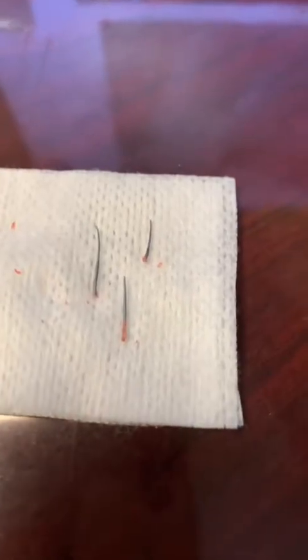These are the plastic Thermafil obturators I pulled out of the canals. So this came out of the mesiobuccal, this came out of the mesiolingual, and you can see how short it is because, as I said, the dentist didn't instrument all the way to the working length in the mesiolingual, nor did he or she instrument and obturate the distal canal, and missed the canal on the distal as well. But that came out of the distal canal. This came out of the mesiobuccal, mesiolingual, and again, that came out of the distal canal.